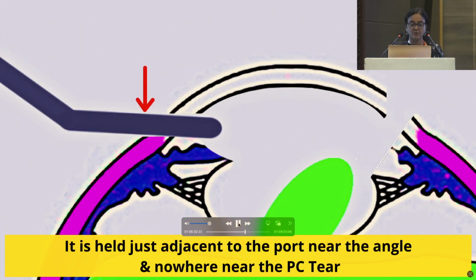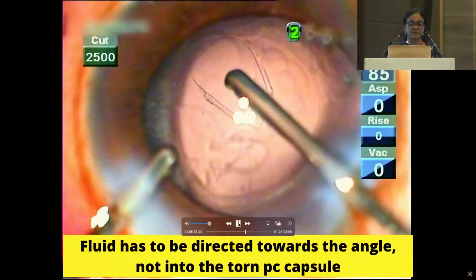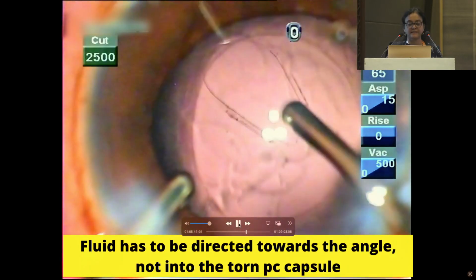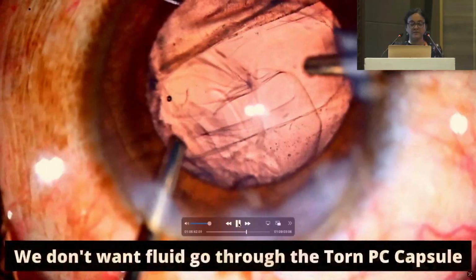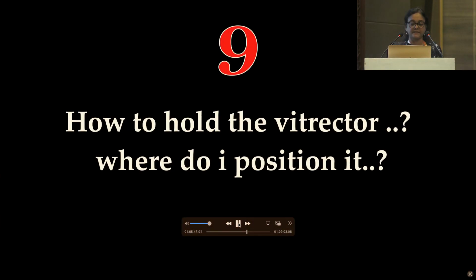Typically, how do you hold the irrigation? The irrigation port should be held in such a manner that you are not going to irrigate the vitreous further and push the pressure inside the vitreous cavity much more. So the irrigation should be directed away from the site of the PC tear.